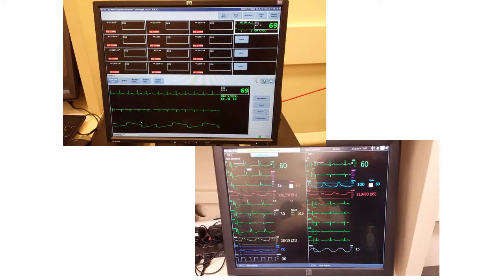This is a screen, and I was multi-vendor, as I know some of you are in the room, so I wasn't picking on any one vendor, they all have different problems. This is a central station image of what a nurse or doctor is actually seeing on a patient. You could have up to 320 variables coming off any single patient. None of those actually correlate with each other to make a decision. They're all individual components. There are some reasons for that. Some of them are claimed to be regulatory. Some of them are claimed to be other things.